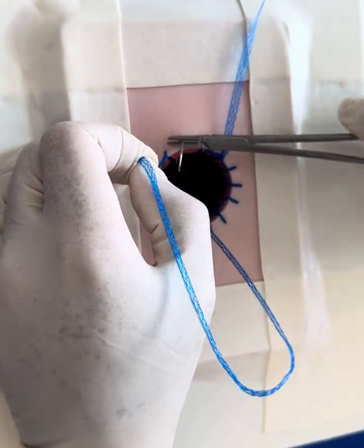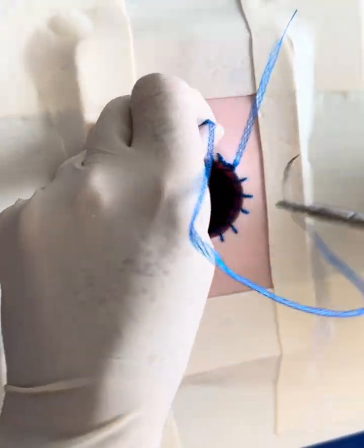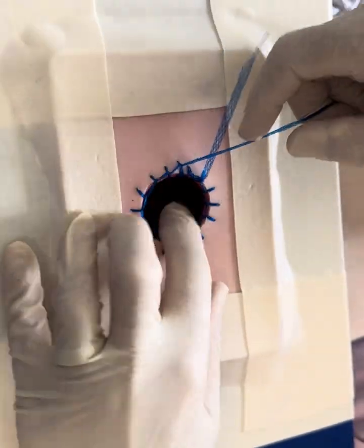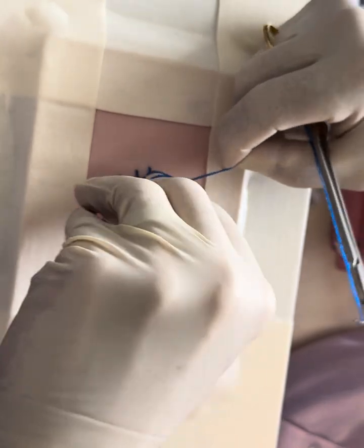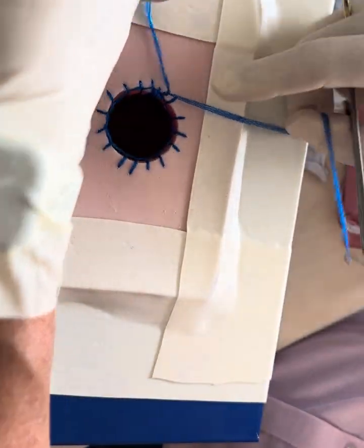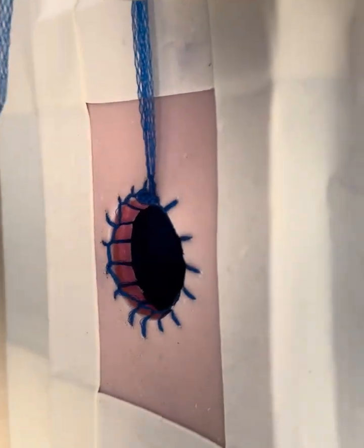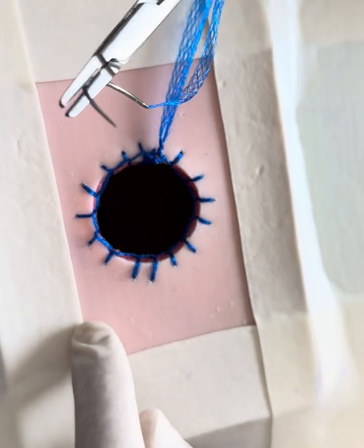Yeah, nearly back at the beginning. That's good. And then we'll bring that through close to our initial point where we anchored. That's good. So that's showing a complete ring. And then we can just join those together. Again, this is not for structural integrity, this is just to hold that first run of stitches in the position we want. So we've got reinforcement at centimetre intervals. You can see there, and then we've got a ring of mesh reinforcement around the edge of the stomal orifice.